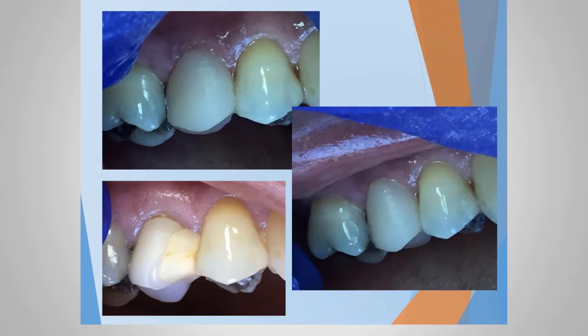As you can see, as we started with this tooth, that just wasn't a good shape. It was impinging on the soft tissue, and it just didn't look good at all. Whereas when we made the temporary, we changed everything up, we took out that material, and we made a better temporary. And this will allow us to have more success when the permanent restoration comes back to us.